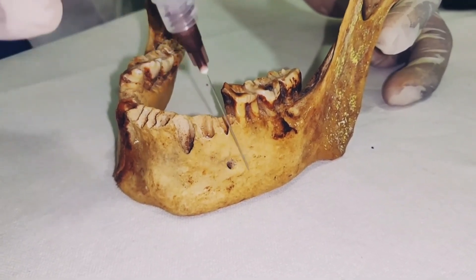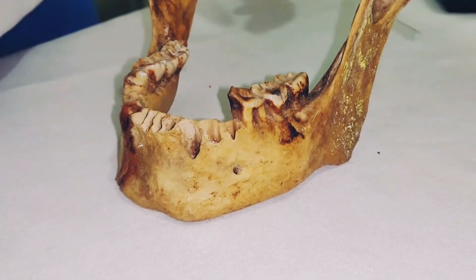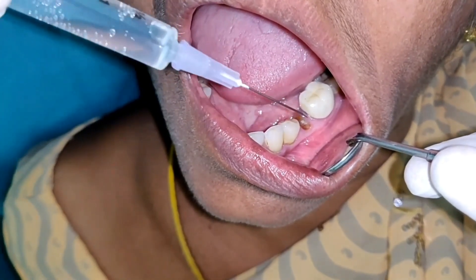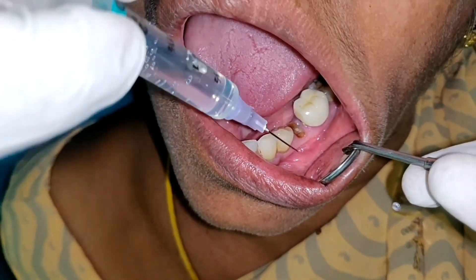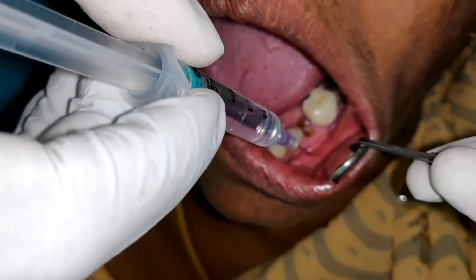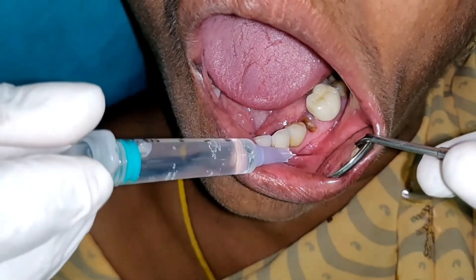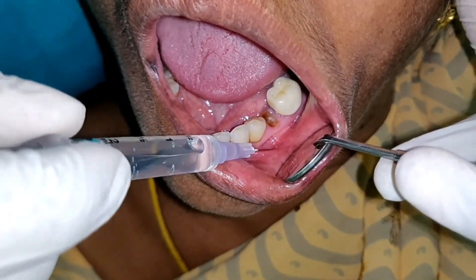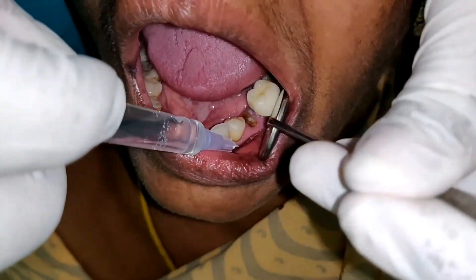So let us look at the procedure in a patient. I'm going to carefully inject the needle between the first and the second premolar. Upon insertion, I'm going to look for any positive aspiration — it's negative — so I'm going to go ahead and deposit the local anesthesia.